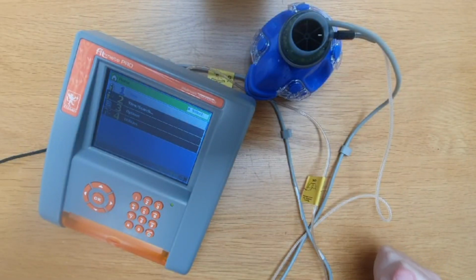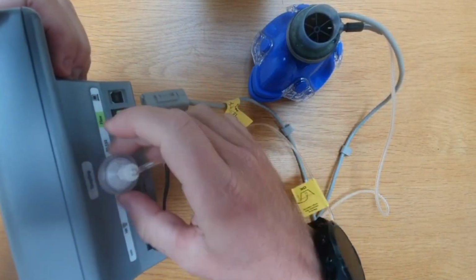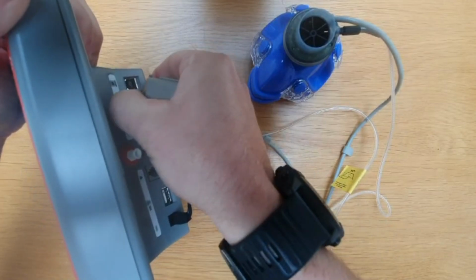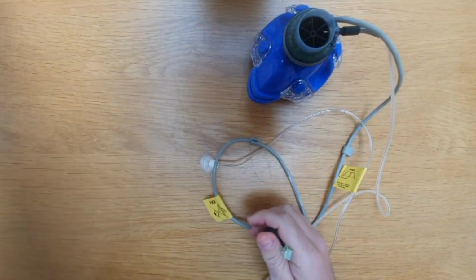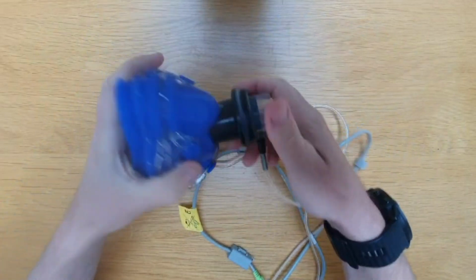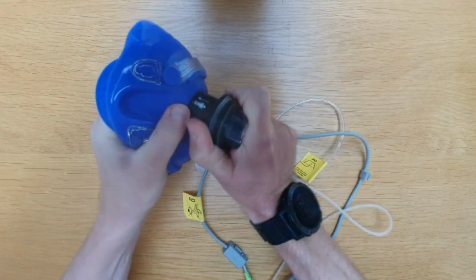Here's how to replace the PermaPure on the Fitmate Pro. First, unscrew the PermaPure from the back of the device. You may also need to disconnect the flow meter. Next, remove the flow meter from the mask.